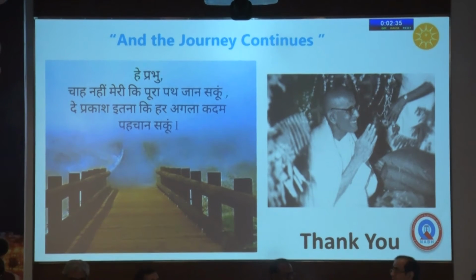Can you ask some questions? Please. So, if you do keratometry on the IOL Master and the Lenstar, and you do keratometry on a Pentacam, how do you compare and which one do you take as more reliable? If there is any irregular astigmatism, it's not reliable, I think.